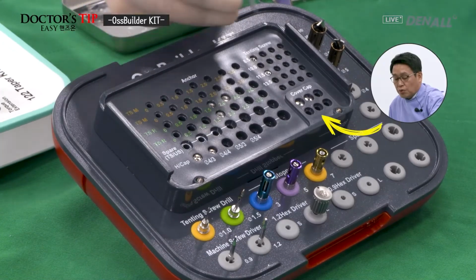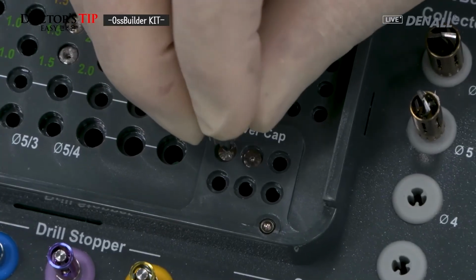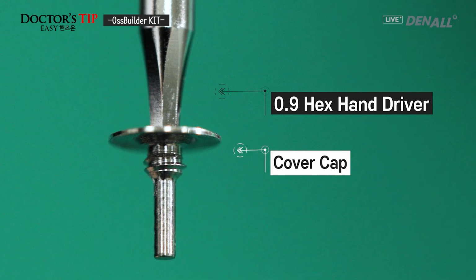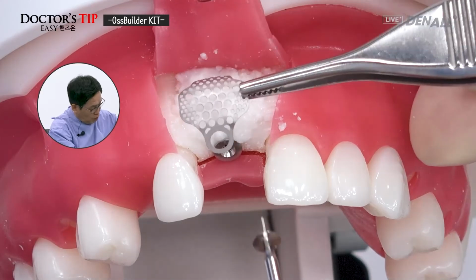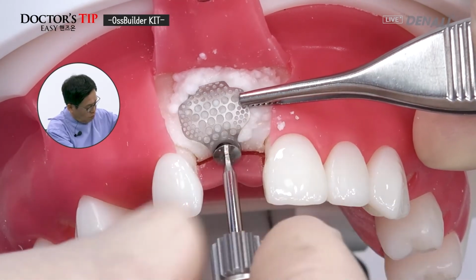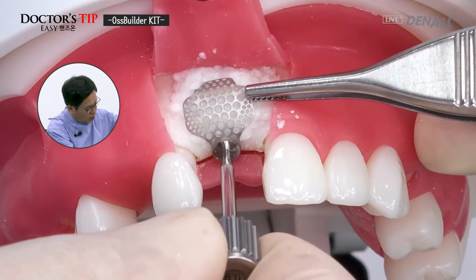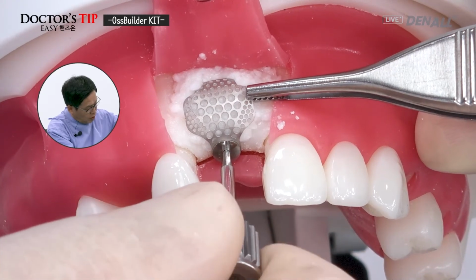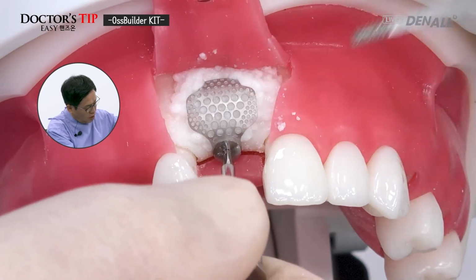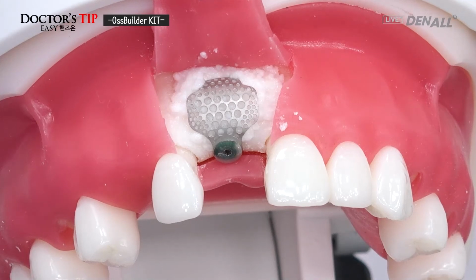Here's a cover cap. There's a healing cap as well. I'm going to use the cover cap. OssBuilder is going to be placed in the desired position. OssBuilder should be fixated using the 0.9 hex driver. I'm going to tighten it, and we're done.